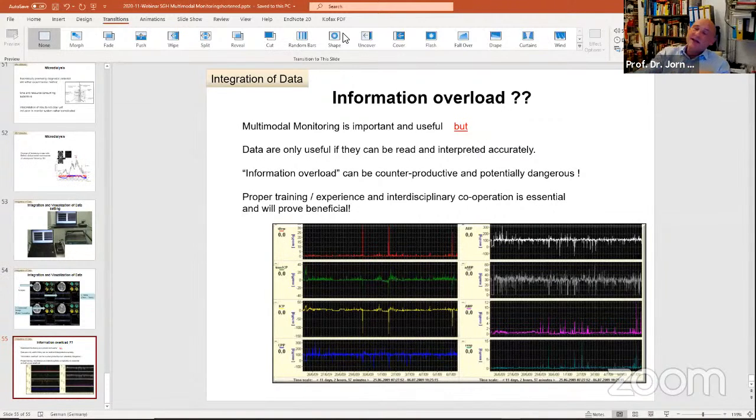And if I go back to Professor Jarber's remarks, I have put probes in patients with subarachnoid hemorrhages, with infarcts due to vasospasm. If you see the PO2 is down and you do a repeat scan, and you see the infarct got bigger, then you can take out the probe and put a new one further back. It's useless if it's in an infarct. You don't need it there, you can take it out.